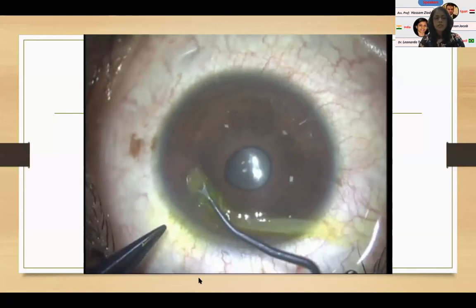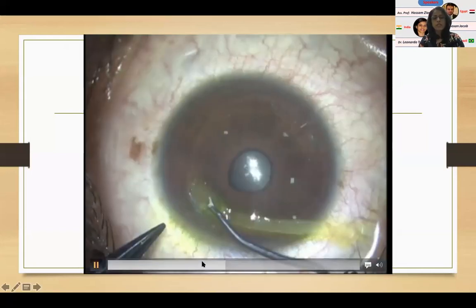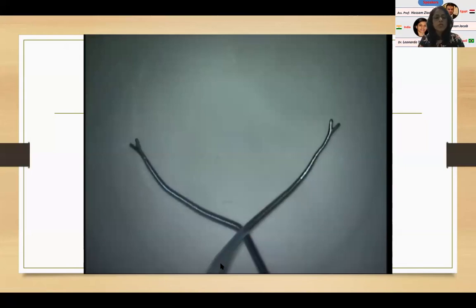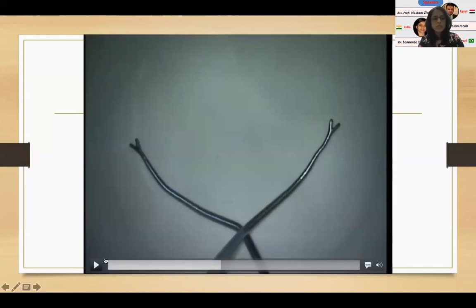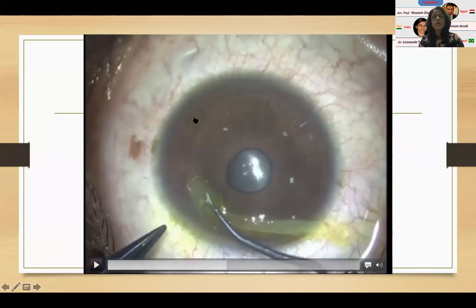These are cataract instruments, which I've basically redesigned, or actually just bent out of shape, to get this curve so that I can easily feed those segments into the laser dissected channels. And just as you do for ICRS, I have dissected out, using the femtosecond laser, a 360 degree channel on the patient's cornea. And I've put two entry incisions. You could also do it with one, which I've done in a couple of cases, but two makes it easier.